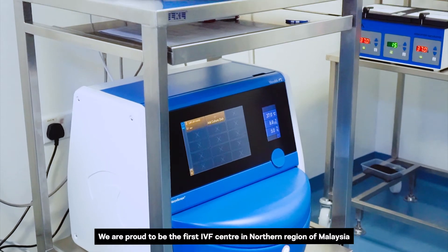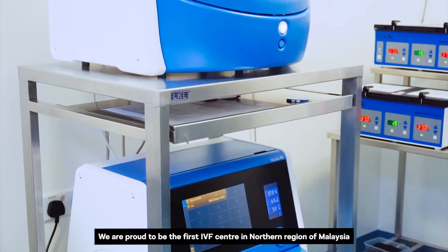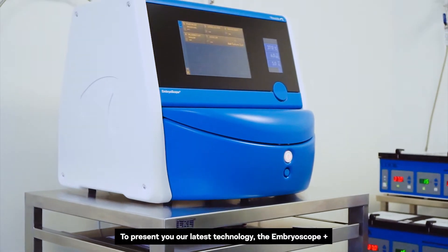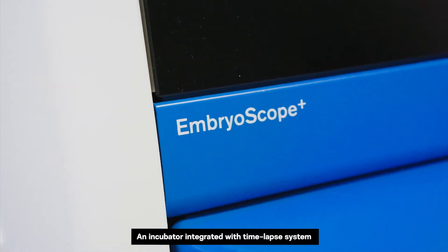We are proud to be the first IVF centre in the northern region of Malaysia to present our latest technology, the Embroscope Plus, an incubator integrated with a Time-Lapse system.